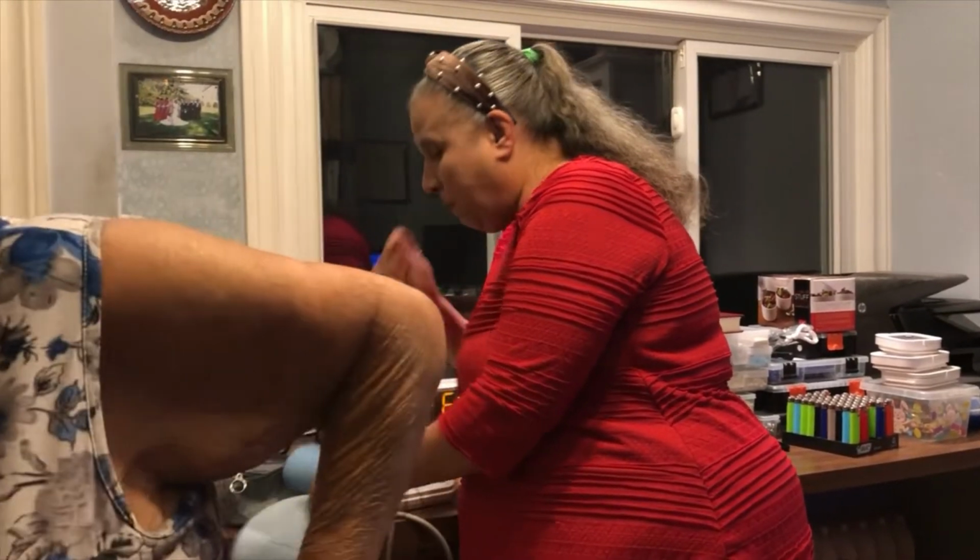So that's our blood pressure monitoring, and I just want to show you one last time on myself. So let's say you don't have somebody. Now, I'm using a desk office chair. It's got arms on the sides, so that way you can comfortably put your arm and bend. Your elbow, your arm needs to be bent at the elbow, and your feet have to be flat. And because this is an office chair, I can raise it or I can lower it. So I've lowered it right now so my feet can be totally flat.